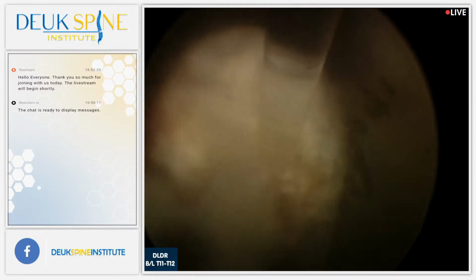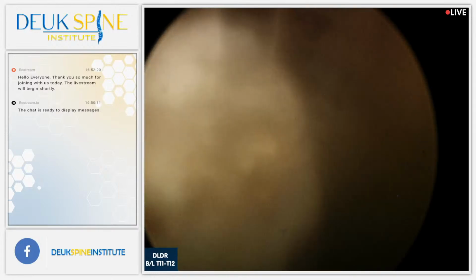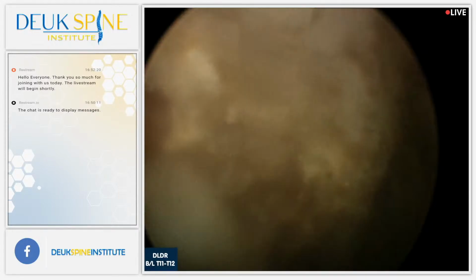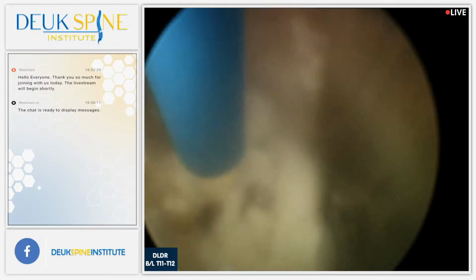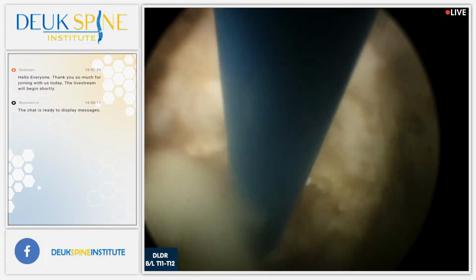After this, we're going to move on to the piriformis muscles. She has horrible pain in her buttocks from torn muscles, and it's called piriformis syndrome. Very common problem, and fortunately there's a way to fix it now, where we go in and release the tension in the muscle.